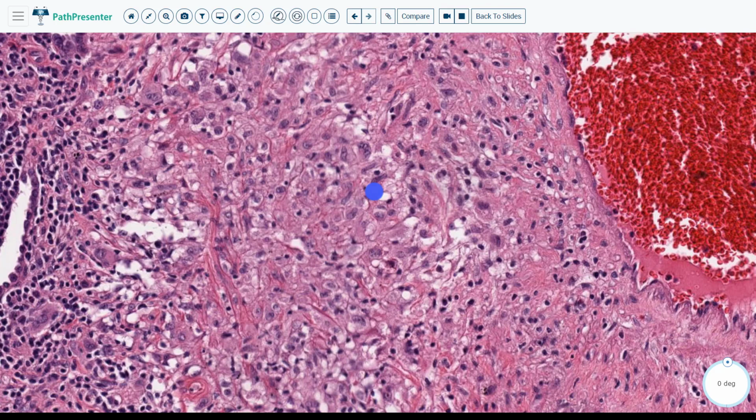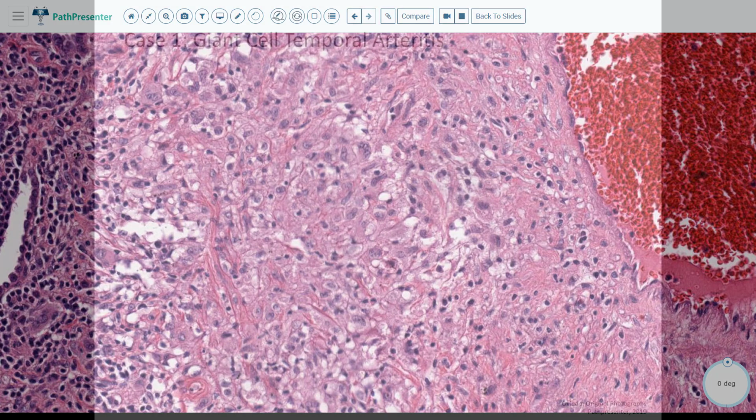This is, of course, Wegener granulomatosis, which is also known as granulomatosis with polyangiitis. This inflammation is triggered by a T-cell mediated hypersensitivity reaction to inhaled microbial or other environmental antigens. You will remember this can also affect the upper airways. You can also do diagnostic laboratory studies. Approximately 95% of patients with Wegener granulomatosis will be positive for PR3 ANCA. Let's go on to our summary slides.